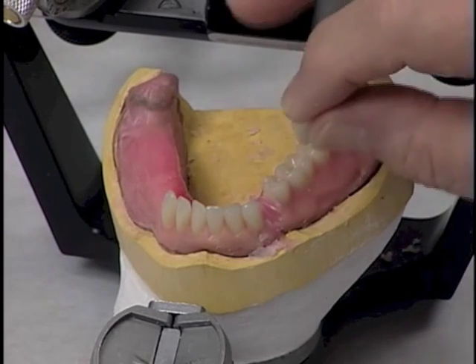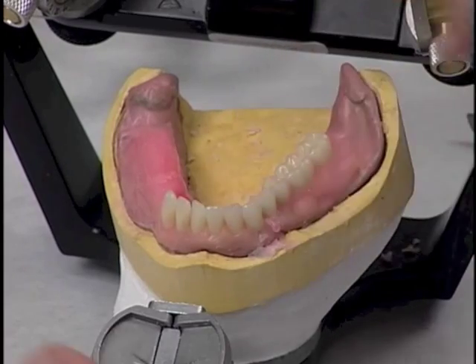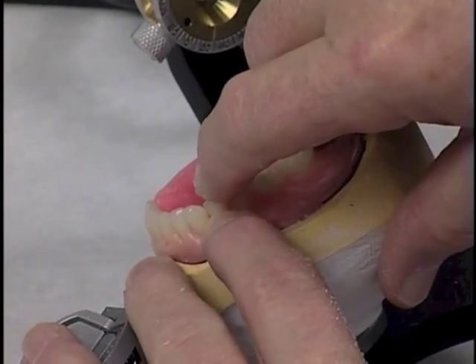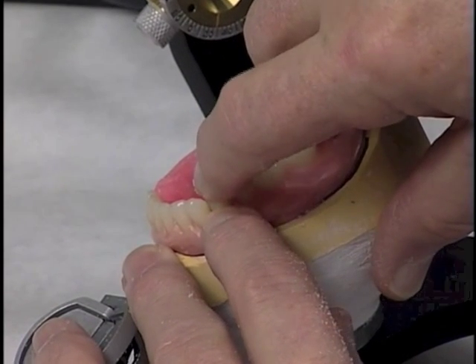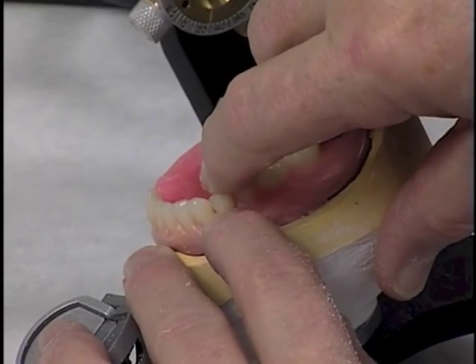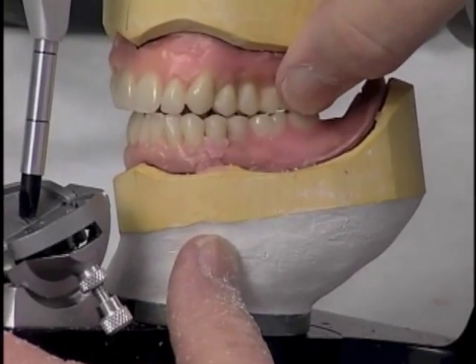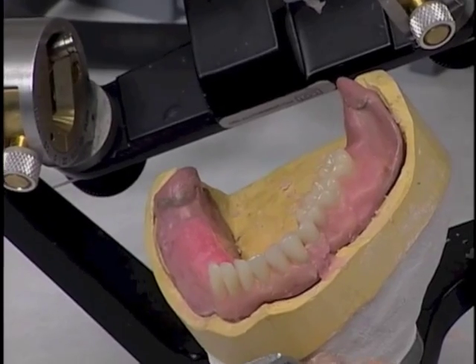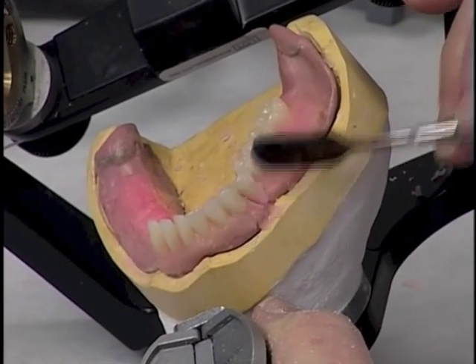Now we have the wax pool, and we just arrange the tooth for aesthetics so that basically the cusp height falls into the curvature that we started with. And since that is a first premolar, we do not expect much function out of that tooth. We're primarily concerned with aesthetics with it, and that's in pretty good shape now. Stabilize the tooth by flowing the wax around it and smoothing it out.